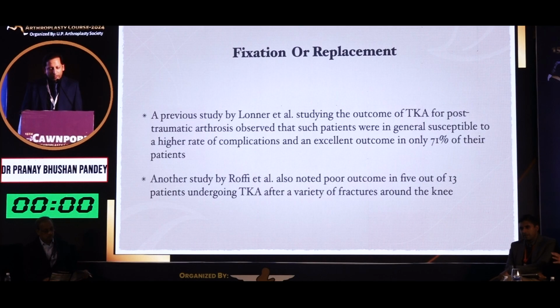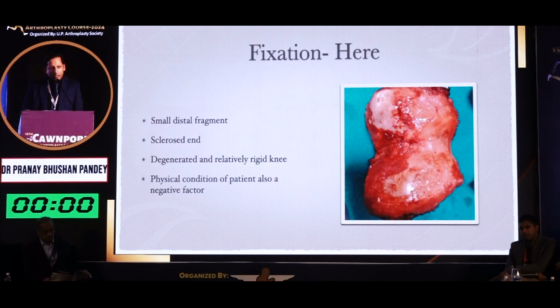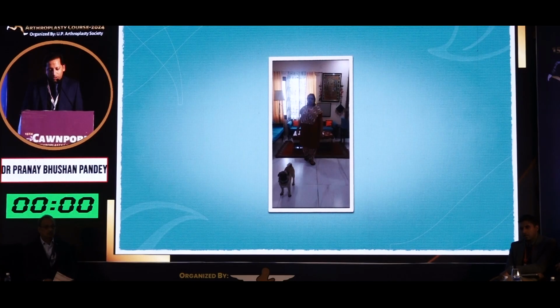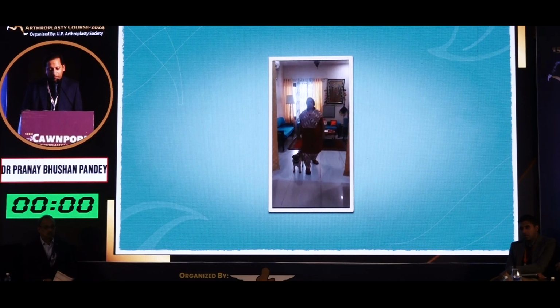result compared to fixation. And in this case, there was a small sclerotic segment in the distal femur. So this I would not have attempted to fix. And finally went in for a distal femur replacement. And with good results post-op, walking, ambulating nicely.